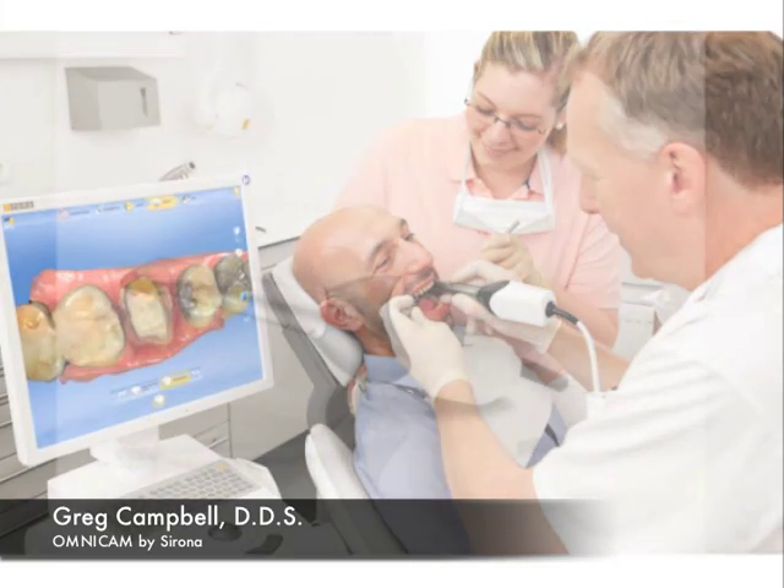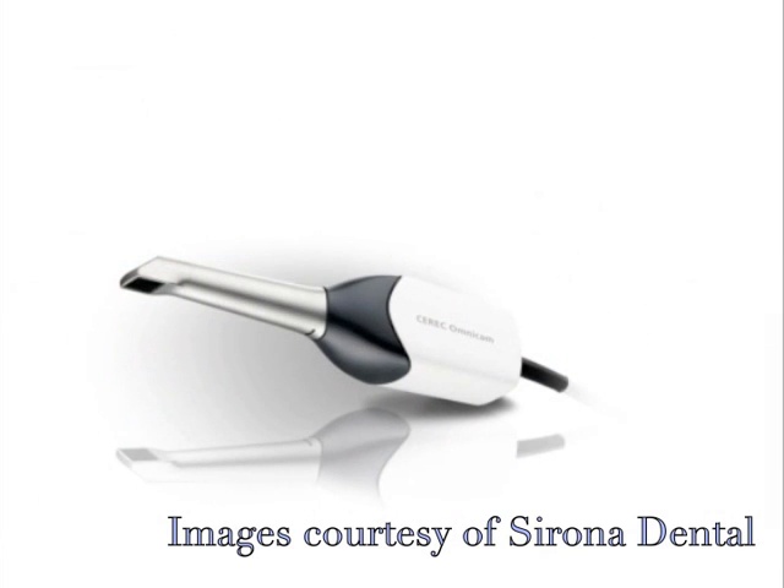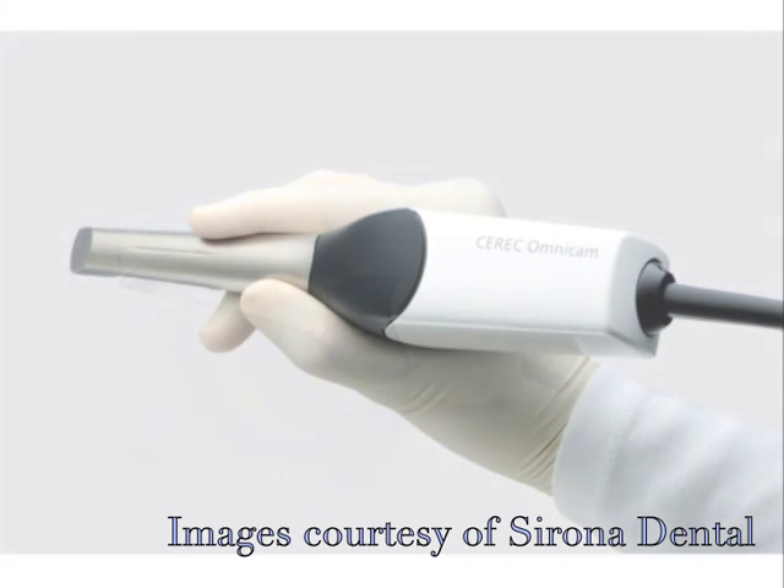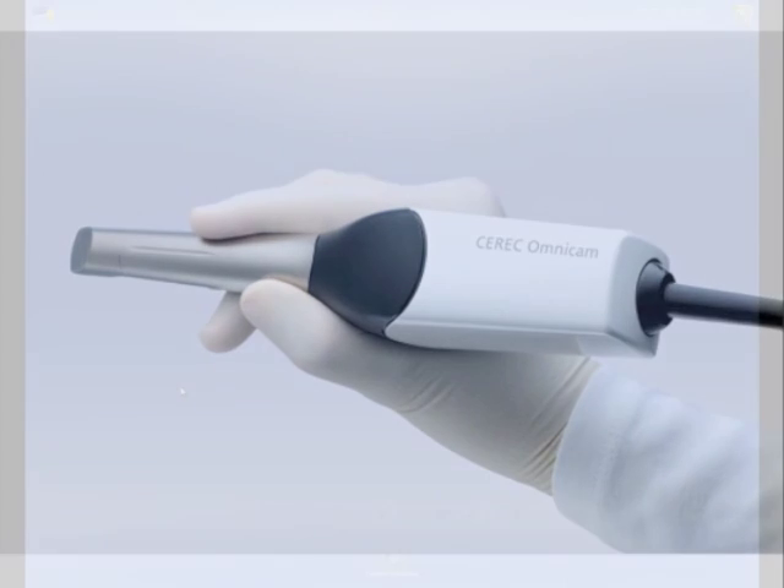The first thing you're going to notice: this camera has a 42% smaller imaging head than the BluCam. Not that there's anything wrong with BluCam, but this camera was designed for access to the mouth. It feels like a handpiece. It's weighted very, very well. Sirona did a fantastic job on balancing the feel of this camera.